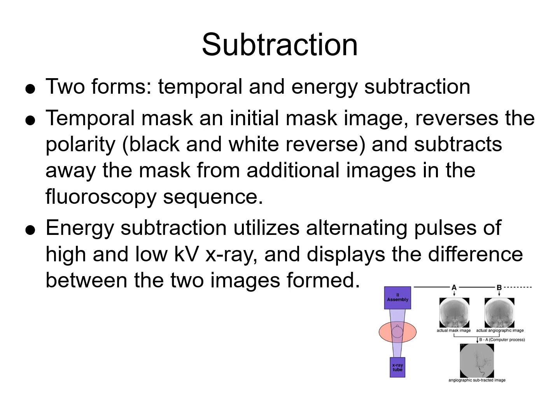Because you've changed the subtraction formula by adding in an X-ray absorber. And so the X-ray absorber gets in front of some of those pixels and changes the intensity that you're measuring. So you're not subtracting away enough anymore to cancel out the pixel. And so the only pixels that show up are the ones that are enhanced by contrast. Okay?